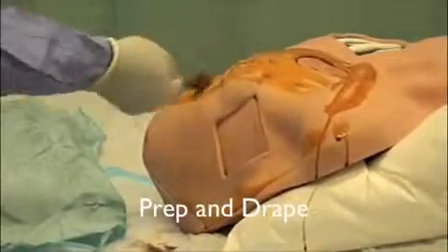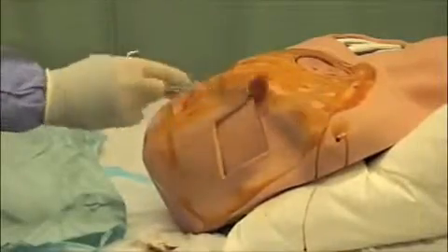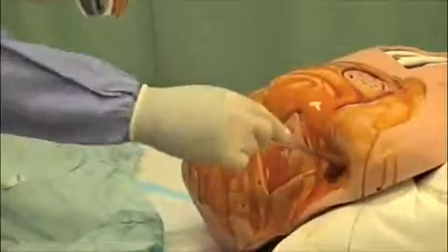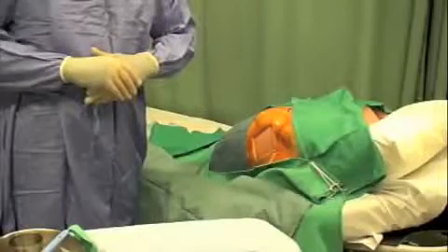Using povidone, prep a large area. Include the region from sternum to posterior axillary line and clavicle down to inferior rib margin. Remember to prep the axilla. Prep for a total of 3 times. Drape the entire area.